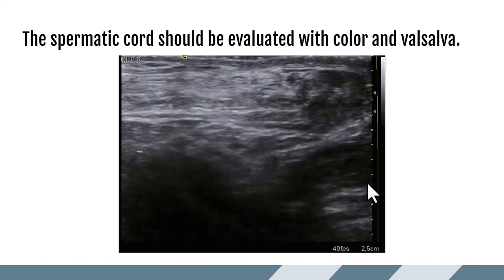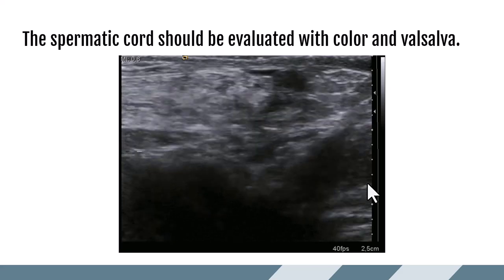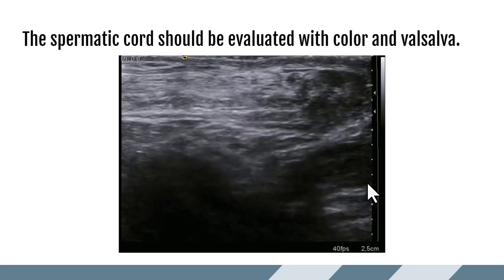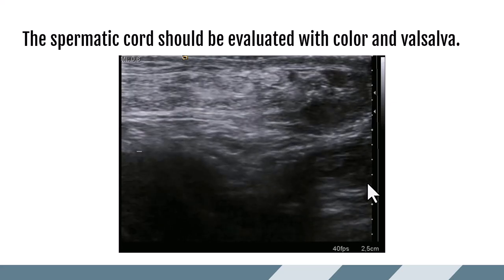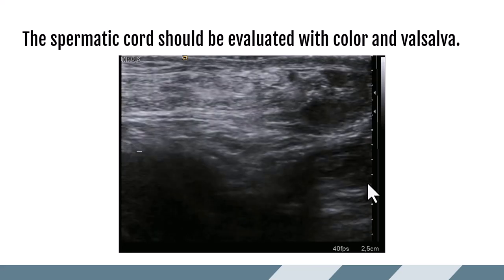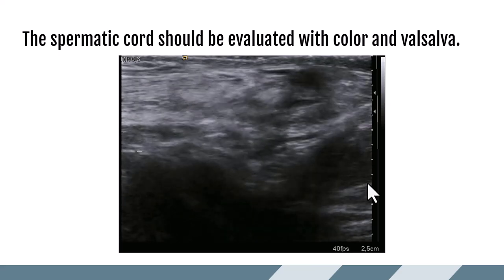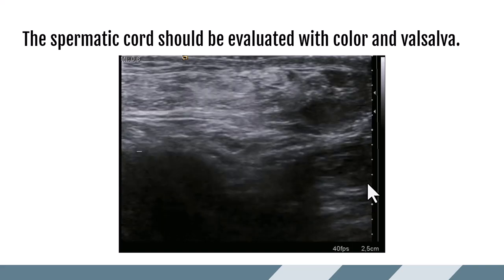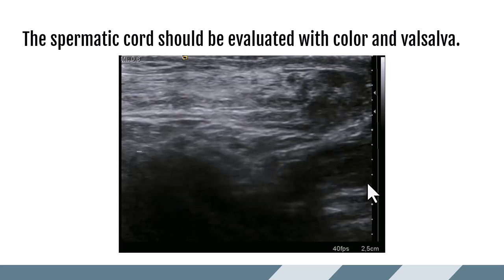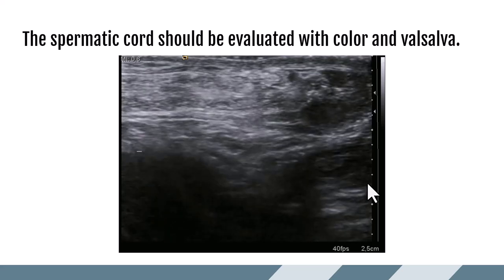The spermatic cord should also be evaluated with color and a Valsalva maneuver. The color will show if there are any dilated veins leading to a diagnosis of varicocele, or any other masses or vascular abnormalities. The Valsalva maneuver shows how things are moving — is there an opening between the abdomen and scrotum that might allow bowel to herniate through, or is there a vascular abnormality like a varicocele at the level of the spermatic cord? In this clip, as the patient performs Valsalva, we can see the structures moving due to intraabdominal pressure.